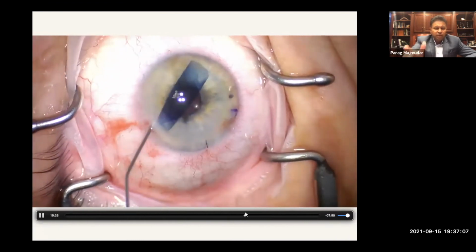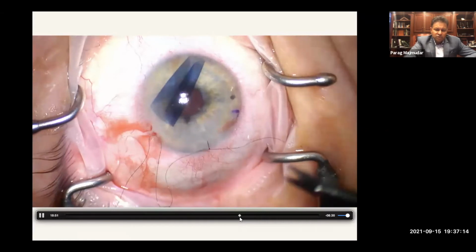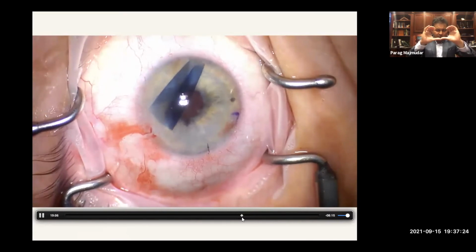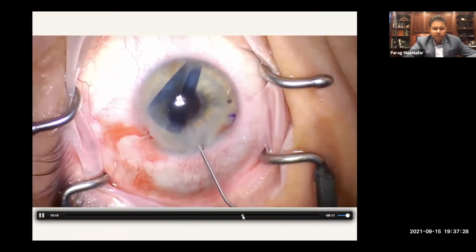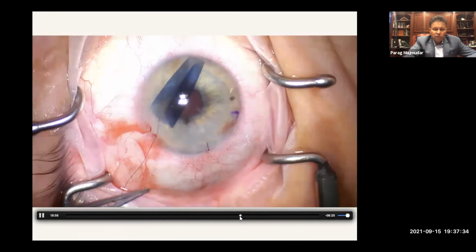Now here I'm doing my DMEK procedure, where you all hopefully are familiar with this. And this is really nice because I've got a situation here where the graft is already kind of unscrolled. It looks to me in a 3D fashion that it's in the right configuration with the scrolls pointing upward. I also, of course, use the S stamp, and that's really been very helpful and beneficial to me. And here we can see how we go about getting this to unfold.